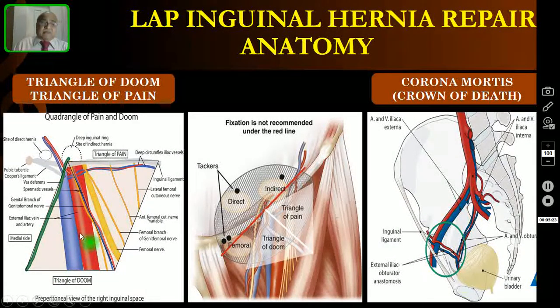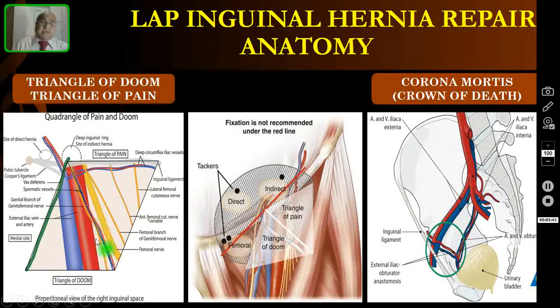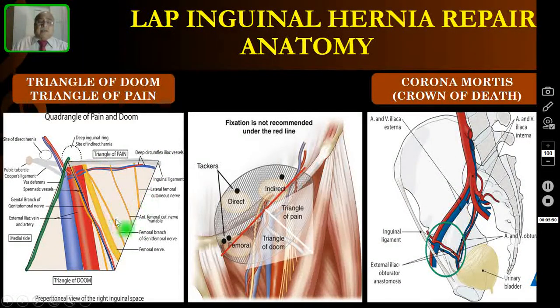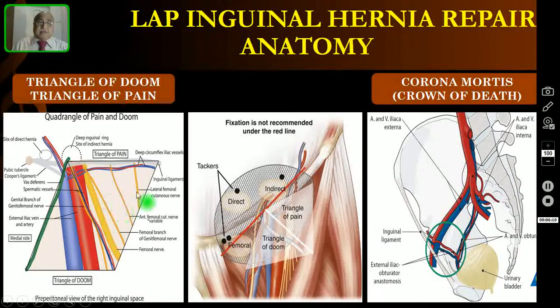The adjacent triangle of pain is formed by the iliopubic tract above and the gonadal vessels, and is an inverted triangle containing many nerves. When fixing the mesh, you should not apply sutures, staplers, or tacks over these areas. If you dissect or apply tacks in the triangle of doom, you will cause bleeding by injuring the major vessels. If you apply tacks in the triangle of pain, the patient will have severe neurological pain postoperatively.